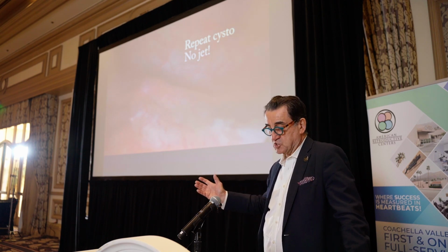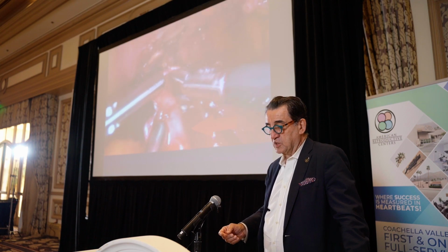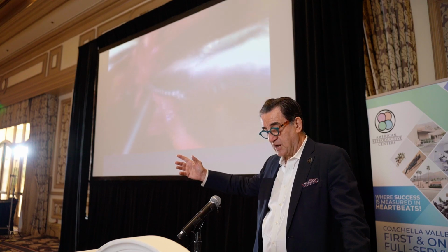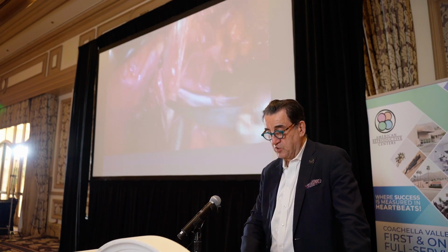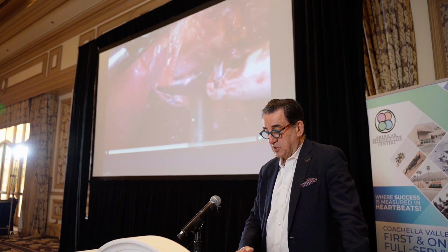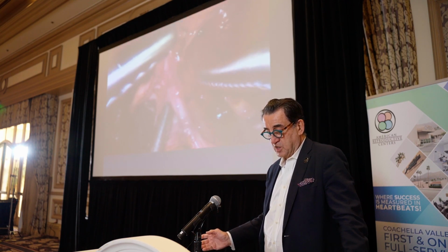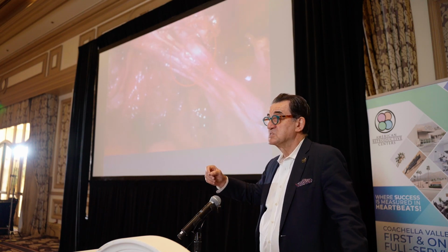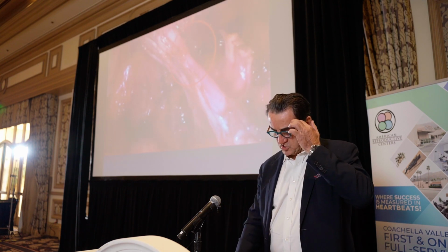And we did the resection of endometriosis on this patient. So before calling the urologist to put the stent, I decided let's follow the ureter all the way down, because we had already done the ureterolysis. So we basically followed the ureter all the way to the bladder, and we did not find any injuries on the ureter. So there were no stitches, no injuries. Then the urologist came and he put the stent in, and everything went fine. It turned out she didn't have kidney function.